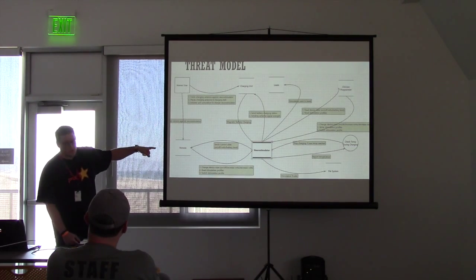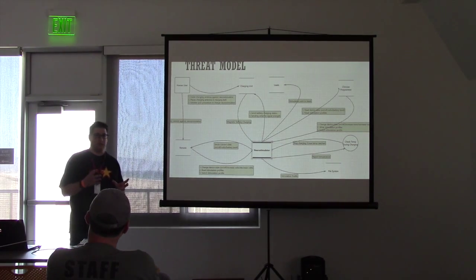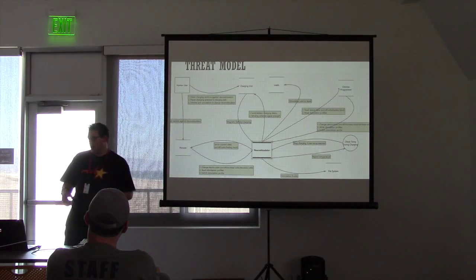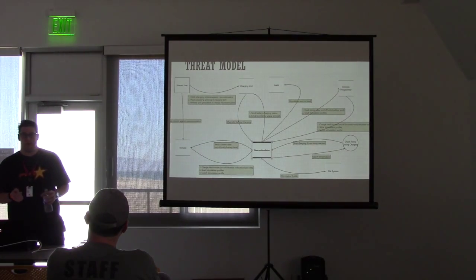So I showed the remote. There's also the patient programmer, the clinician programmer, which is a giant device that the hospital uses to program it. So she goes into her doctor's office and they send programs to this device that talk about which leads send the electricity, how many volts, what's the wave pattern, what's the delay. So that could change the wave of electricity. This is not something that the patient can do themselves. They do have to go to the doctor's office for that. Unlike some of the models you've seen with defibrillators, the doctor cannot do this from remote.